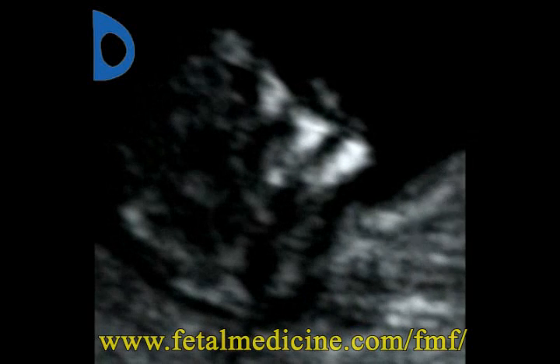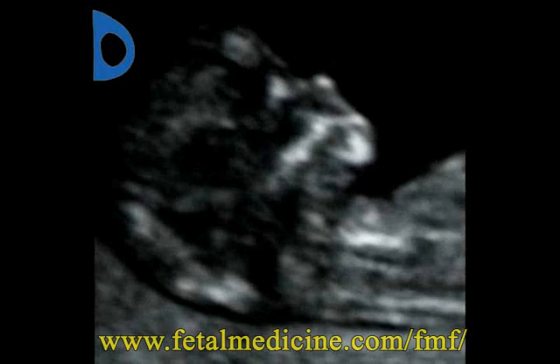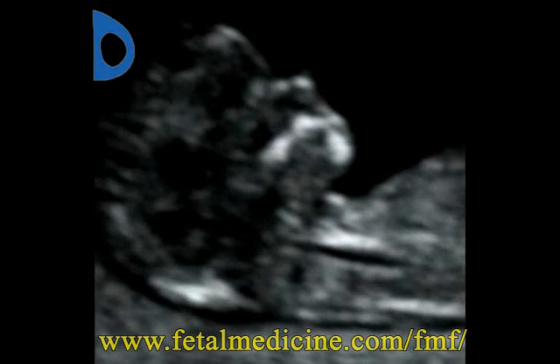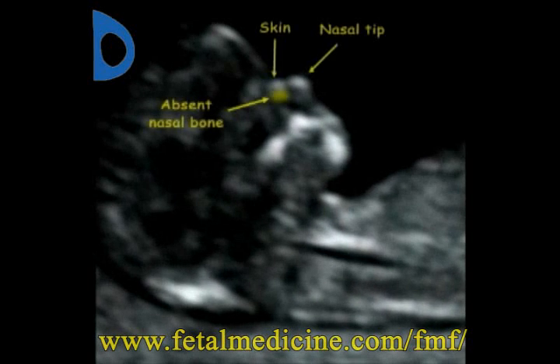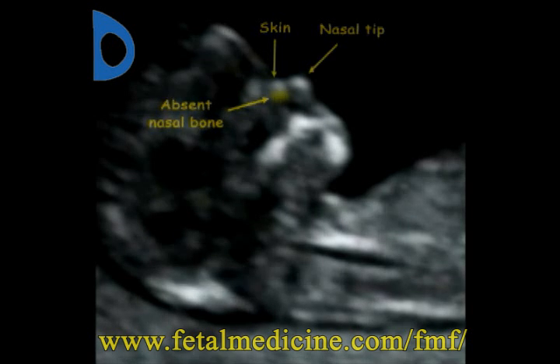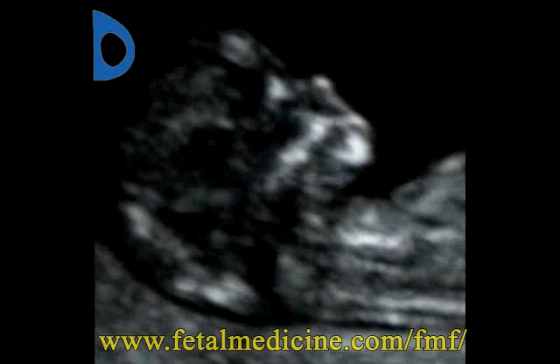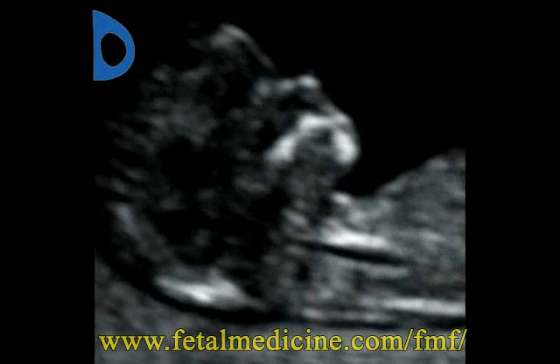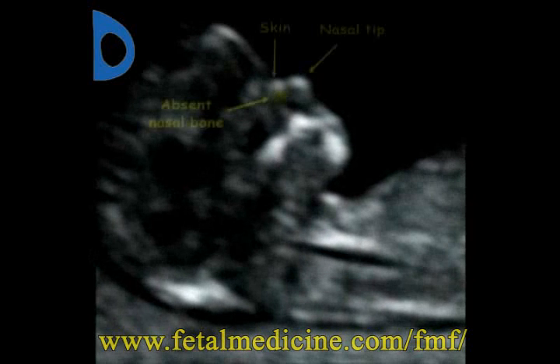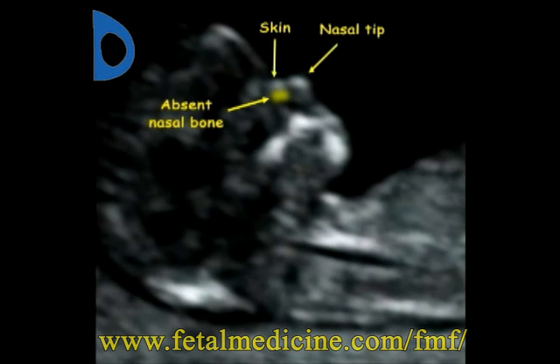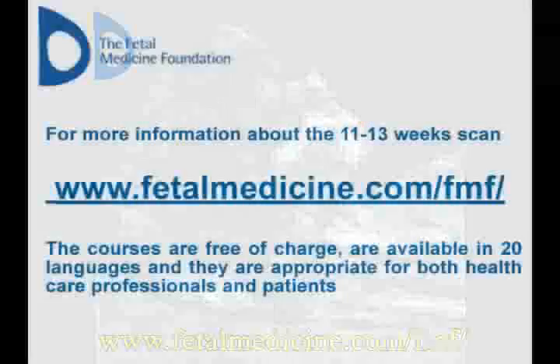At 11 to 13 weeks, there is absence of the nasal bone in 1 to 3% of chromosomally normal fetuses, and in 60% of fetuses with trisomy 21. However, the vast majority of fetuses with absent nasal bone are normal and have a normal pregnancy outcome.